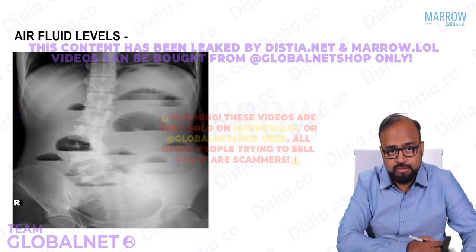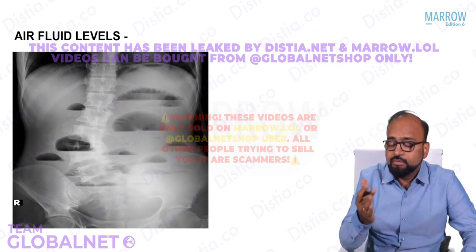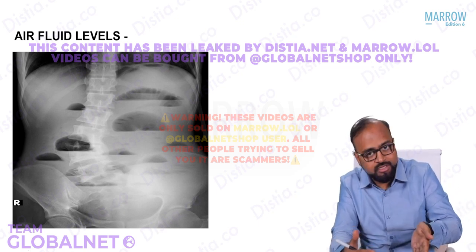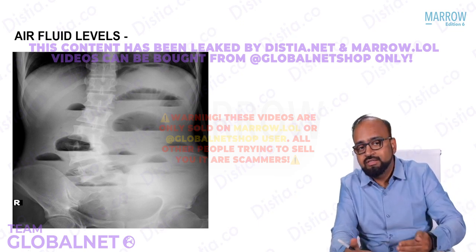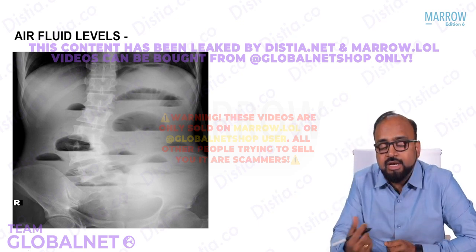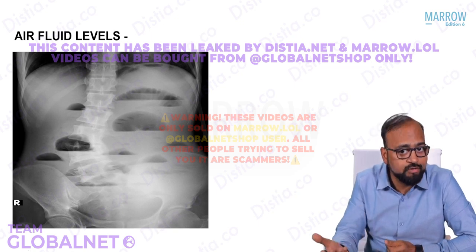Now see, air fluid levels is another feature of bowel obstruction. We have seen how the difference in air fluid levels is. In small bowel obstruction there are multiple air fluid levels. Can you see here? And again, these are short width air fluid levels. This is a feature of small bowel obstruction that you see here. In large bowel obstruction there are few dilated loops but few long air fluid levels.